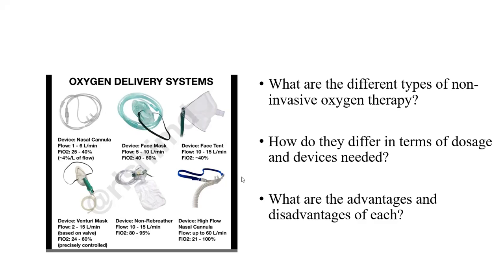Time to Apollinaire now. Okay, thank you very much. I had IT issues with my computer, but as I have been discussing with the questions on the oxygen delivery system, we'll be going through different types of invasive and non-invasive therapy, and the devices we use to provide oxygen.